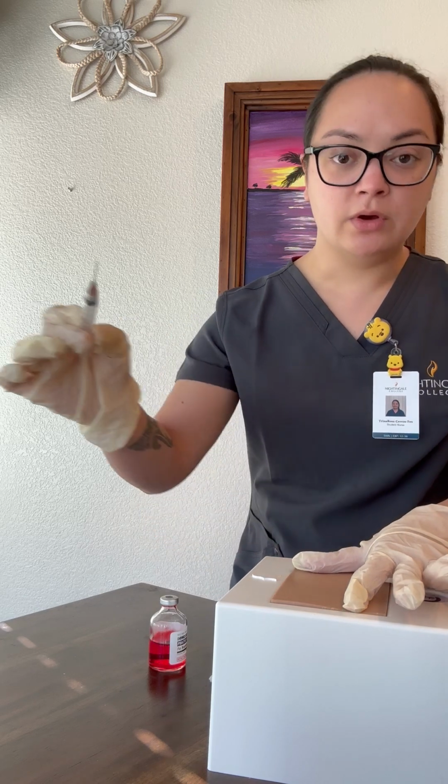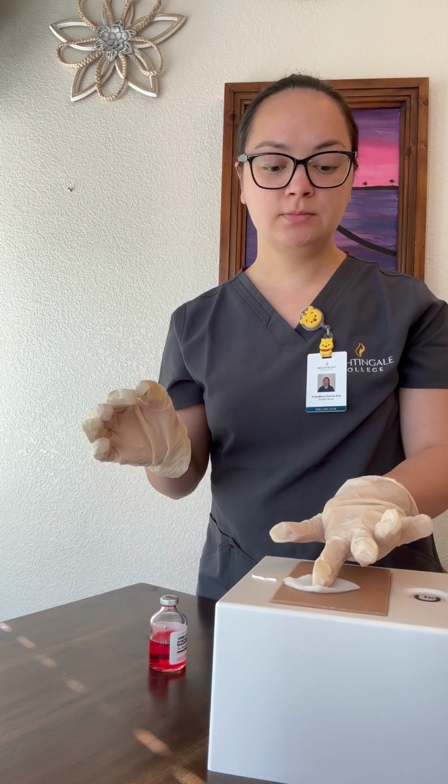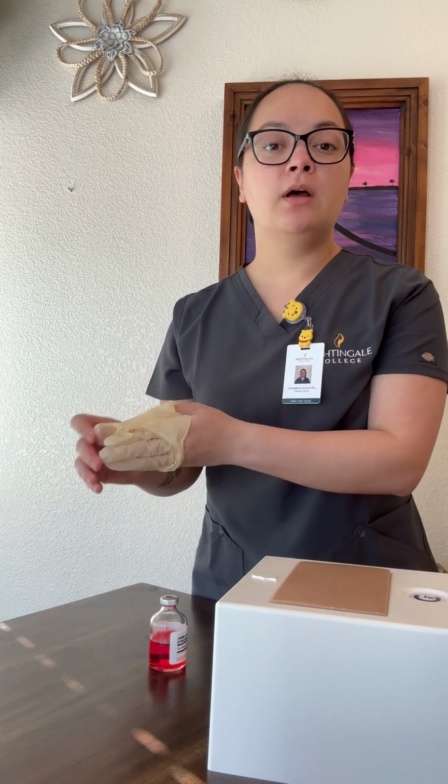Okay, and then we'll go ahead and discard to sharps. We will place a gauze and apply a gentle pressure. Okay, and we'll check for no bleeding. That's good. And we'll discard gloves, hand hygiene, and document our procedure.